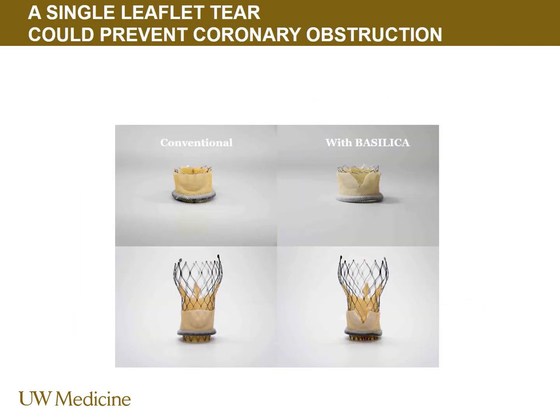The Basilica procedure is a procedure where we lacerate the leaflet. You can see a conventional standing up almost of the bioprosthetic leaflets in the left image. And then on the right image, you could see both with the balloon expandable and self-expandable valve, how one could provide a laceration and thus create access for coronary flow.